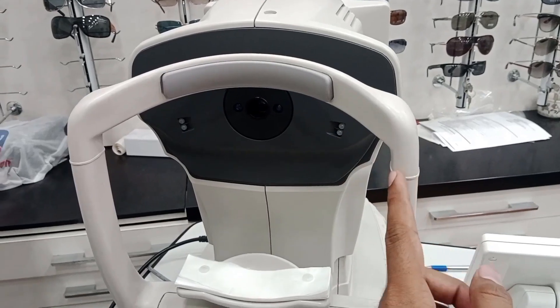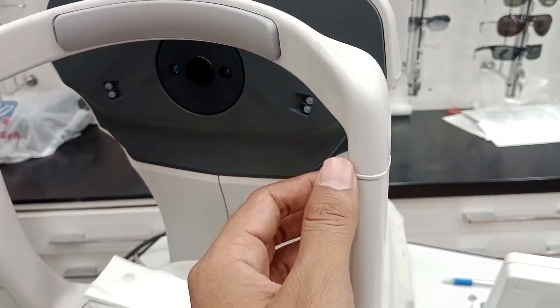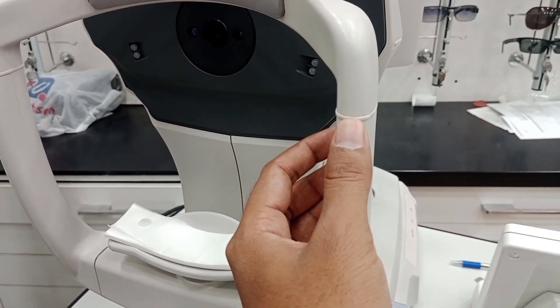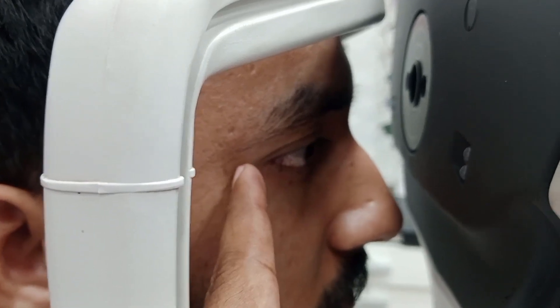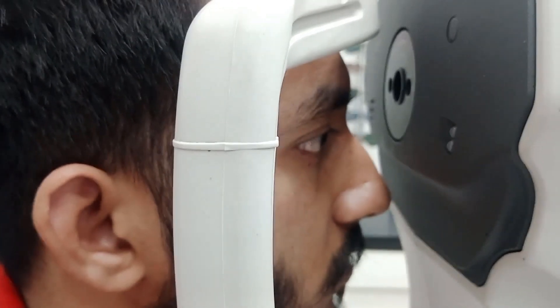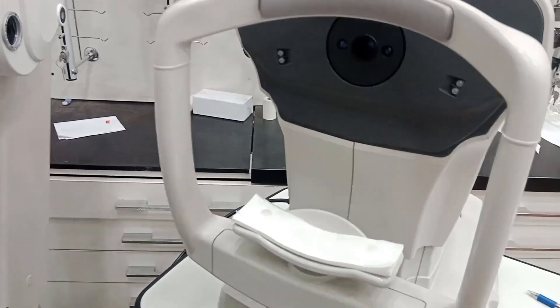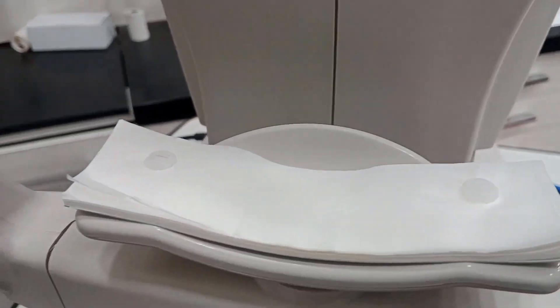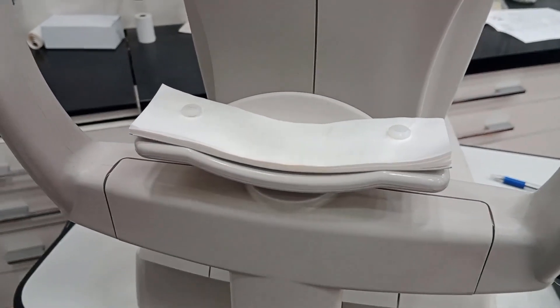This is the chin rest section and this is the forehead rest. The eye height mark is on both sides — you must ensure that the lateral canthus of the patient is aligned with this line. These are the chin rest tissues, which should be replaced after every patient to avoid the spread of germs.